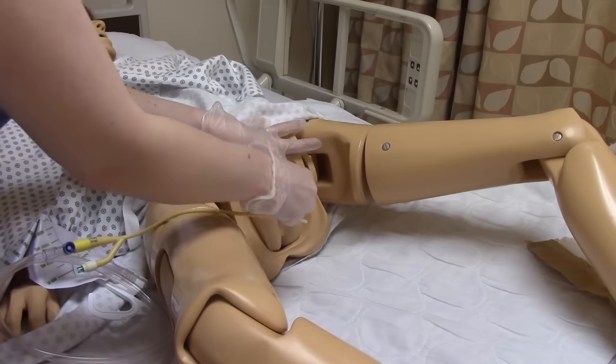Those are just some little extra tips and tricks when it comes to female patients. Female patients can be a little bit more challenging than male patients for Foley insertion — not everybody's anatomy is perfect like the mannequin for practice. If they've just had a baby, have swelling, or are obese, it's going to be more challenging. So good technique, good lighting, and getting your patient into the right position is really going to help you. We hope you found this video helpful — if you have any questions or comments, please let me know, and I'll see you on the next one.